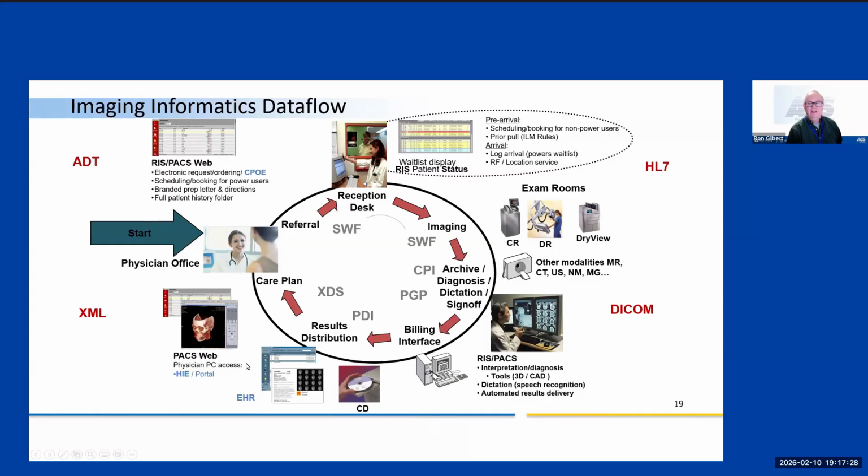One thing a lot of people don't understand: the PACS is not a box. It's not one thing you buy. You don't get it on Amazon, plug it in the wall, plug in the network cable, and now you have one. Although arguably there is such a thing in an orthopedic office if it just does one thing. But in hospitals, the PACS and informatics systems are made up of many IT systems. The ones you have to learn about are the ones you'll interface with and share data with, and you're going to understand those interactions.